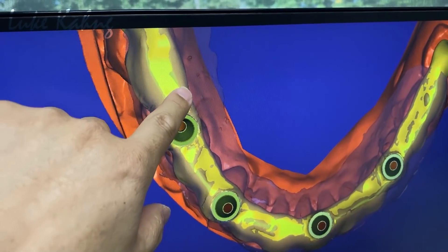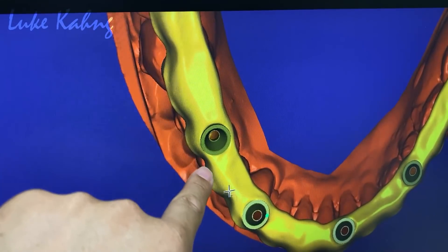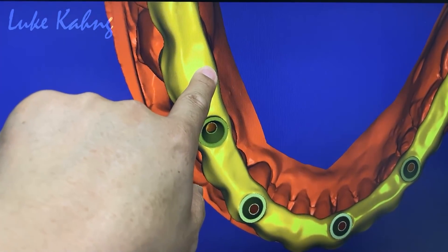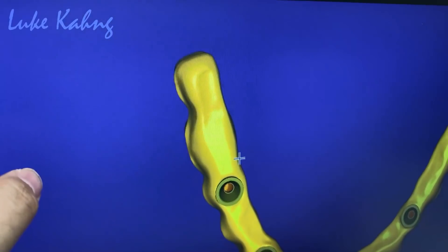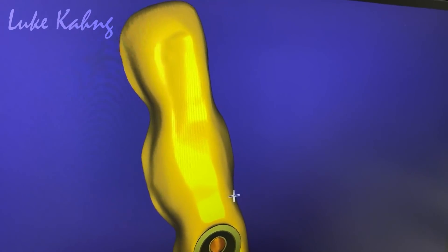Nice. Make it slightly thinner — that's okay, make it exceptional. Because this is the hybrid mirror. We're not welding, we're not soldering. Nice — the other side too.